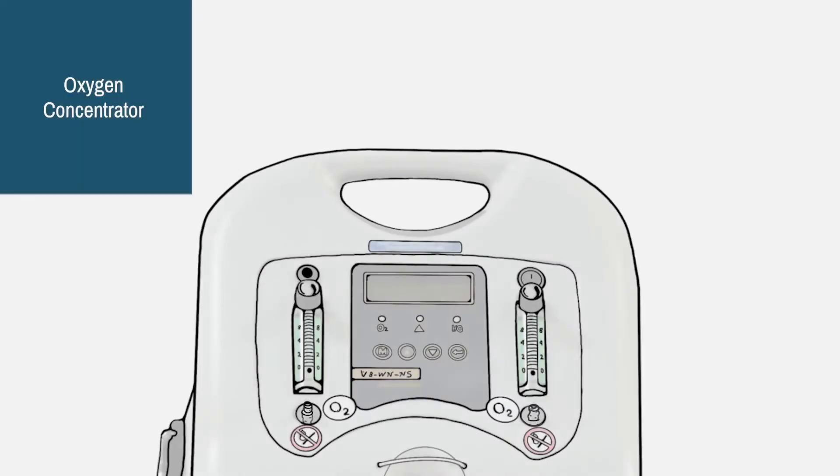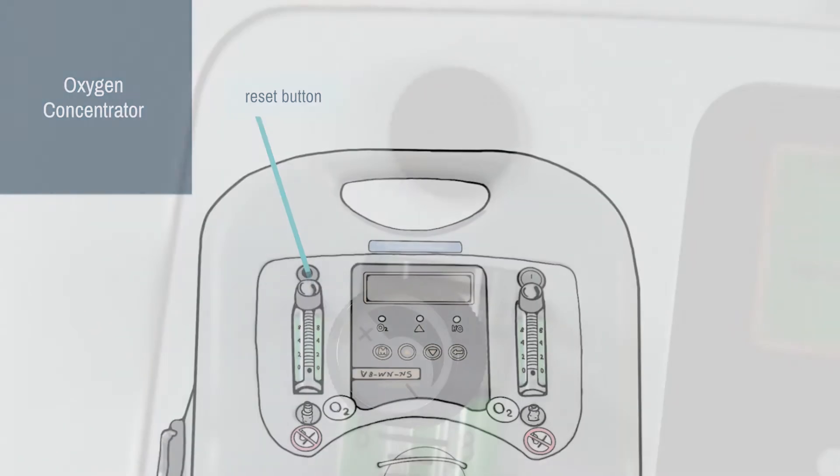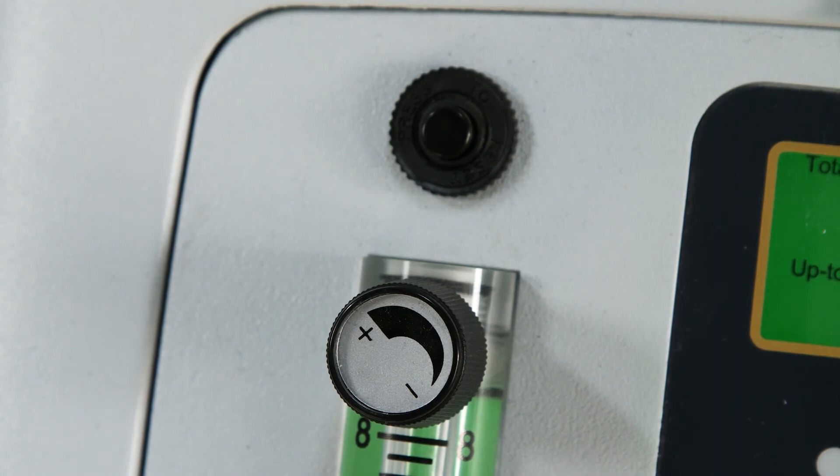Now let's see the other controls. The power switch to turn on the machine is above the right-hand flow meter. On the other side is the reset button. If there is an electrical problem, like a short circuit or a mains power surge, the button will pop out. To restart the machine, turn off the power switch, push the reset button back in, and then turn the machine back on again.